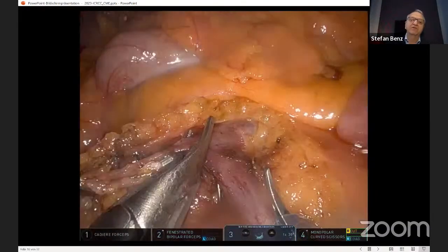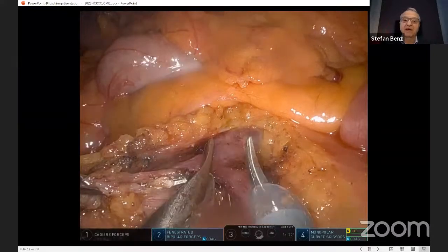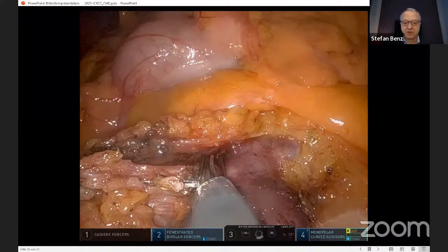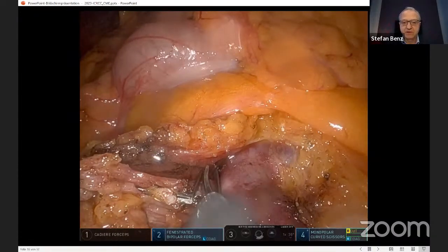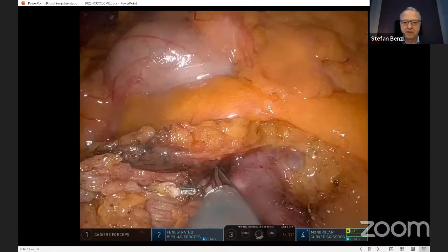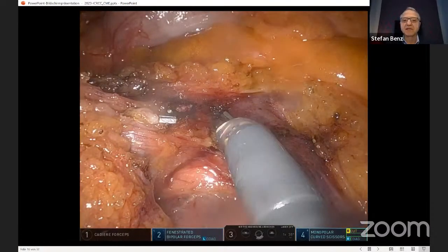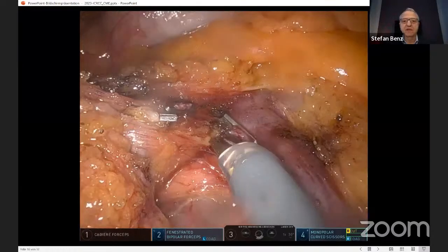And as I said, we have to open the book first, so we don't dissect the Henle trunk veins at this stage, but go to the gastrocolic ligament division. And that's it for that. For this, you can follow it a bit more until you see the Henle trunk, but that's left to your choice. Sorry.